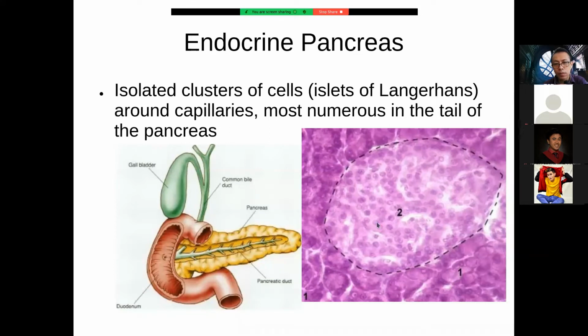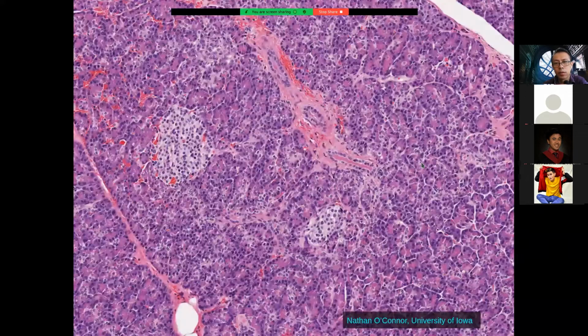But you can miss them because they also fade in the background if you have a very old specimen, as in ancient slide box specimen. So in this nice specimen over here, because of the differing intake of the dye, they stand out for you here. No? So there must be capillaries, and they are lighter staining compared to the surrounding usual pancreatic exocrine tissue.